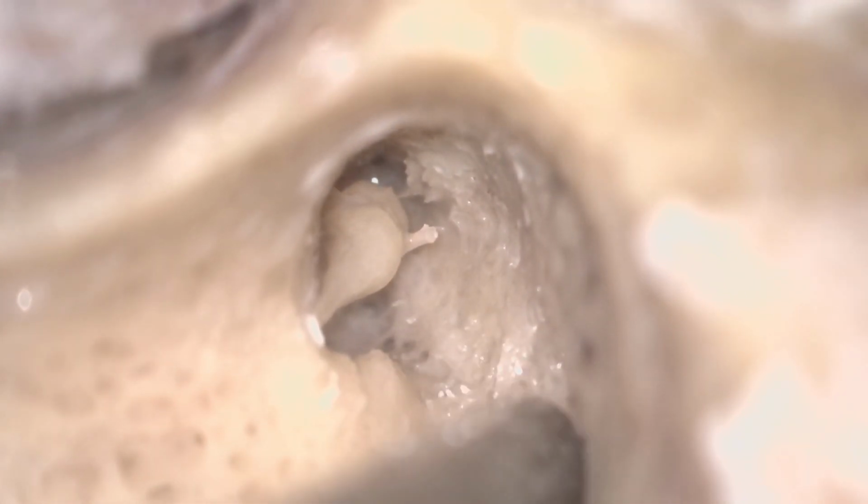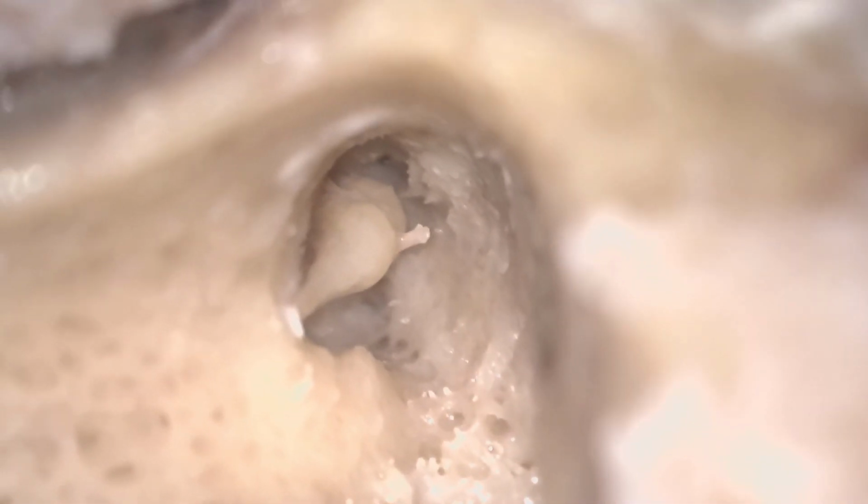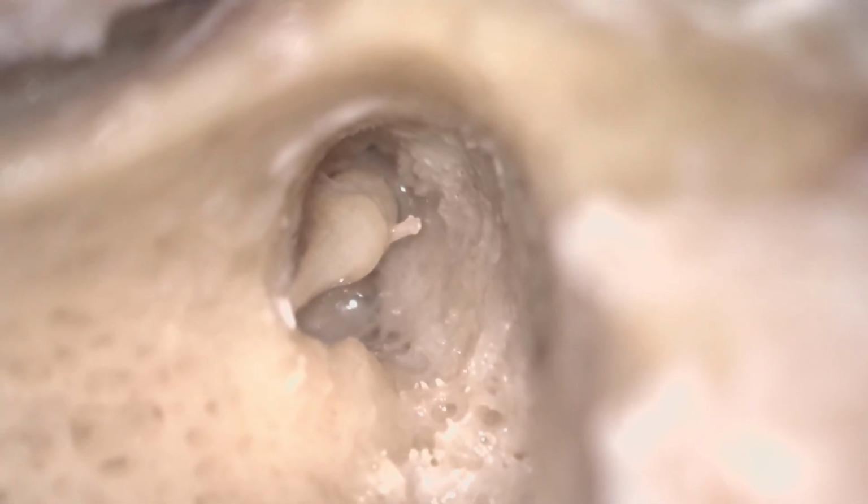Nowadays, when the whole otology is shifting from the microscope to the endoscope, and the anatomical relevance of the middle ear and the mastoid from the endoscopic perspective has been changing, this cog has a very important role. It is an important landmark into the middle ear and the epitympanum. Okay, so we'll stop at that position. This is your incus, this is your malleus, these are all the ligaments and the folds that suspend this incudomalleolar joint, and just anterior to that, this bony projection is the cog.